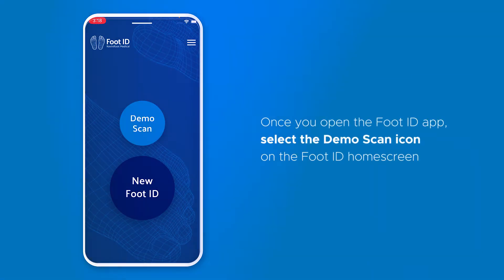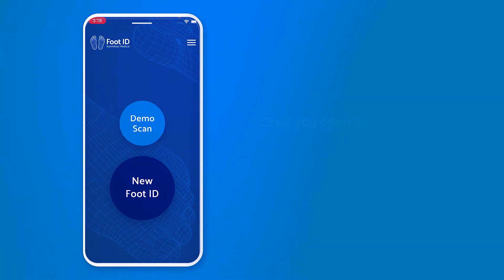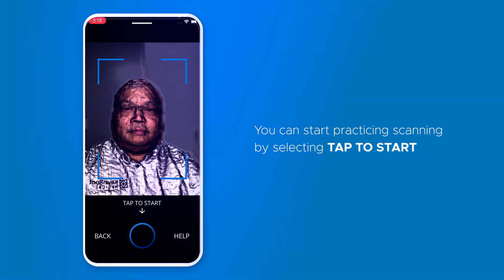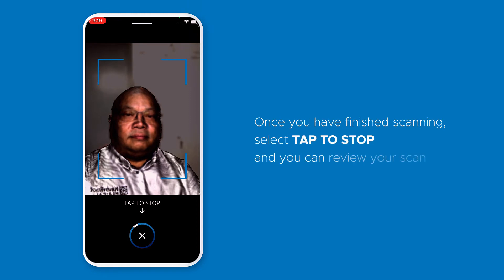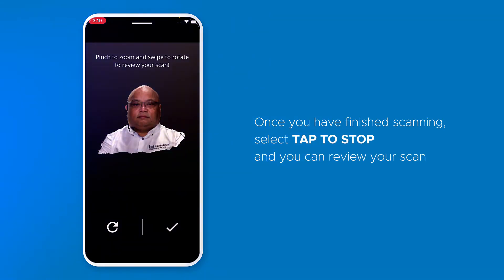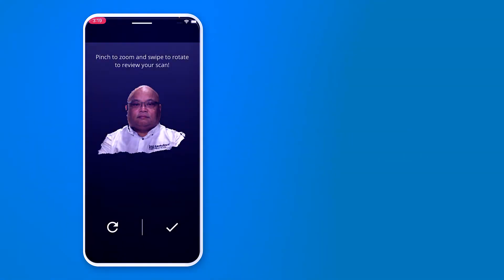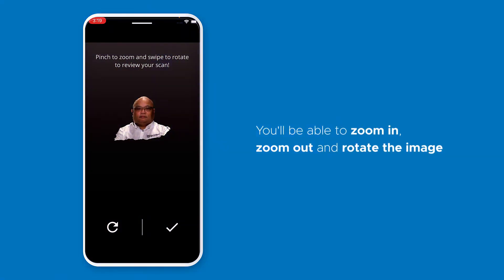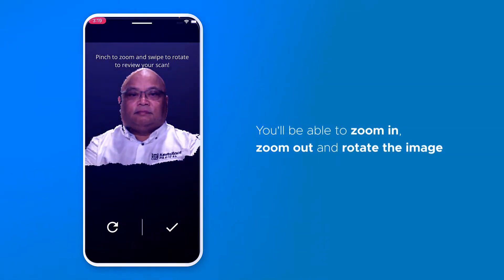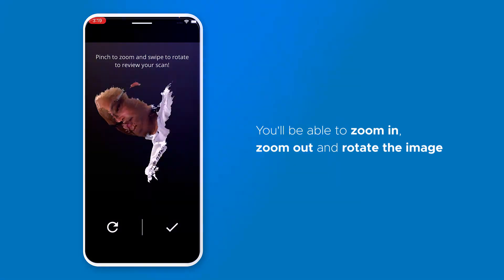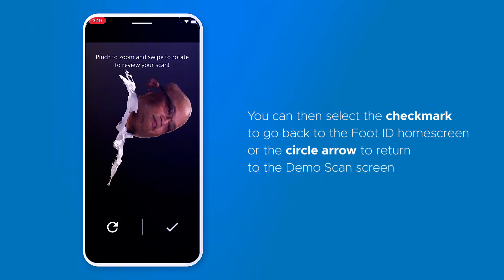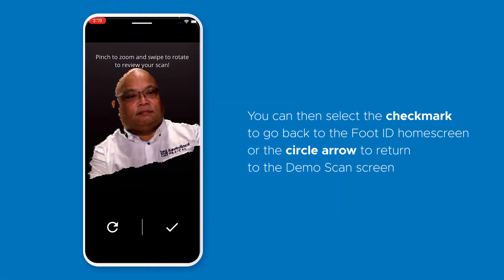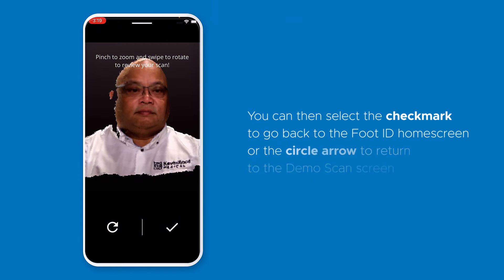Once you open the FootID app, select the demo scan icon on the FootID home screen. You can start practicing scanning by selecting tap to start. Once you have finished scanning, select tap to stop and you can review your scan. You will be able to zoom in, zoom out, and rotate the image. You can then select the check mark to go back to the FootID home screen, or the circle arrow to return to the demo scan screen to continue practicing.